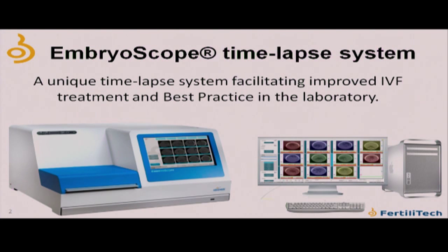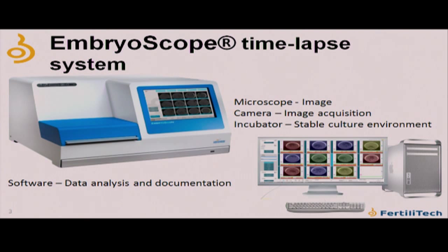So here's the EmbryoScope time-lapse system. I'm not sure if you're familiar with this, but it's essentially two components. First, the EmbryoScope, which is the incubator, the box you see on the side. There's also a microscope inside and an imaging camera. While the embryos are in culture in the laboratory, the embryologist or lab person can check the embryos during development without having to take them out of the incubator, bring them to a microscope, and disturb the embryos, essentially putting them in a room temperature environment, and then put them back into the stable environment for culture. Not only can they watch the embryos during development, they can also have these time-lapse videos later for analysis and documentation.